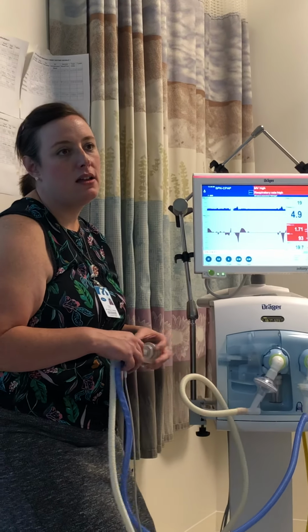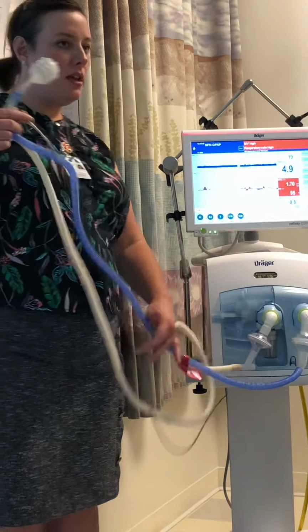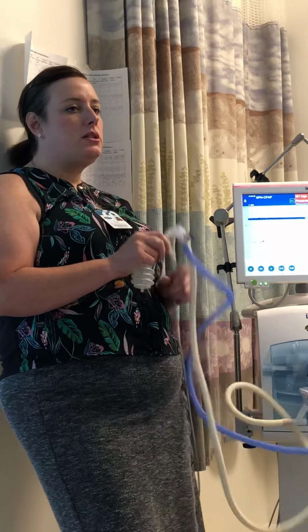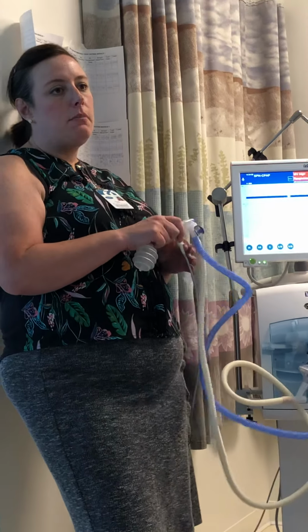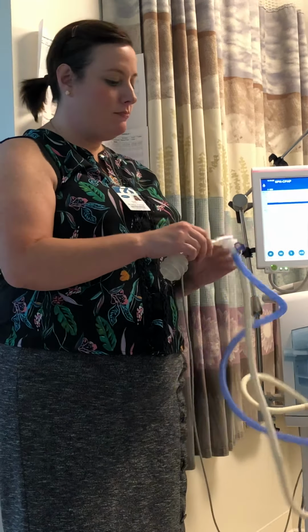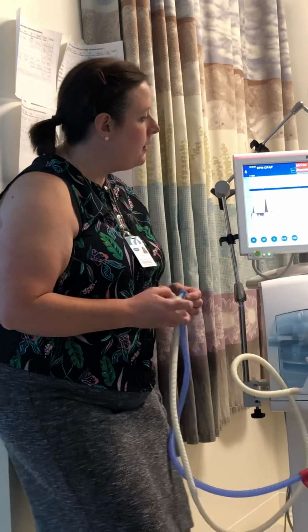Next time you're there, look: is it hooked up to the ventilator or to the patient monitor? Because it might be an end tidal monitor. No, it's to the ventilator. Good for them. The only experience I've ever had with adults and a flow sensor was horrid.